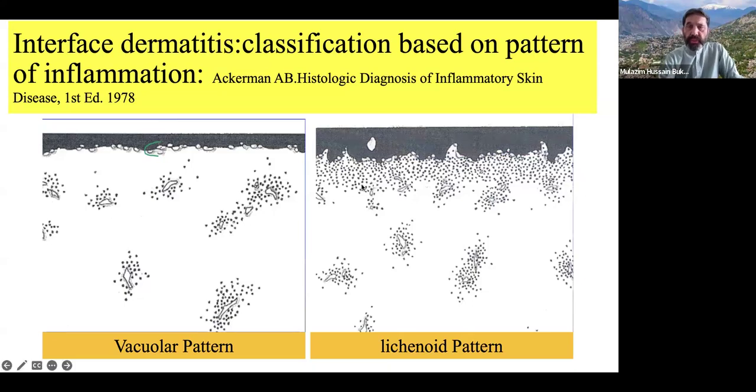And in the second picture, you see vacuolization is decreased, but there is a band of lymphocytes at the dermoepidermal junction, and sometimes these lymphocytes look reactive. New histopathologists confuse that these are lymphoma, pityriasis or something. No. But see, again, these lymphocytes are separately present. And among them, behind them, you can see some macrophages and other cells. While in malignant lymphocytes, there are only atypical cells.